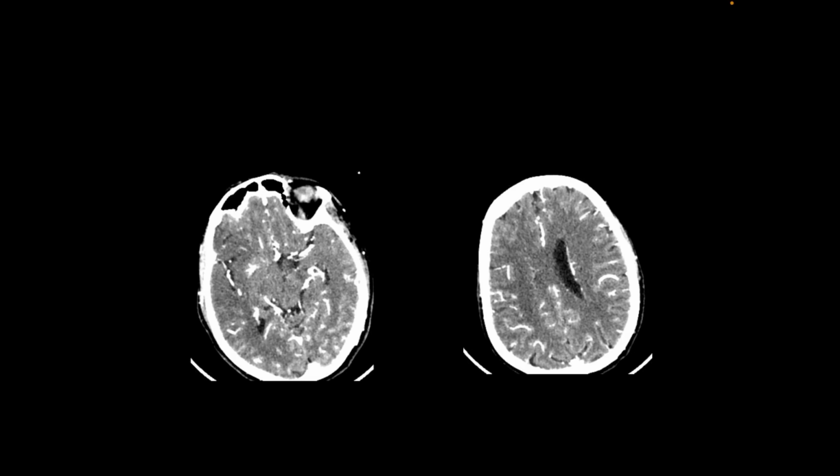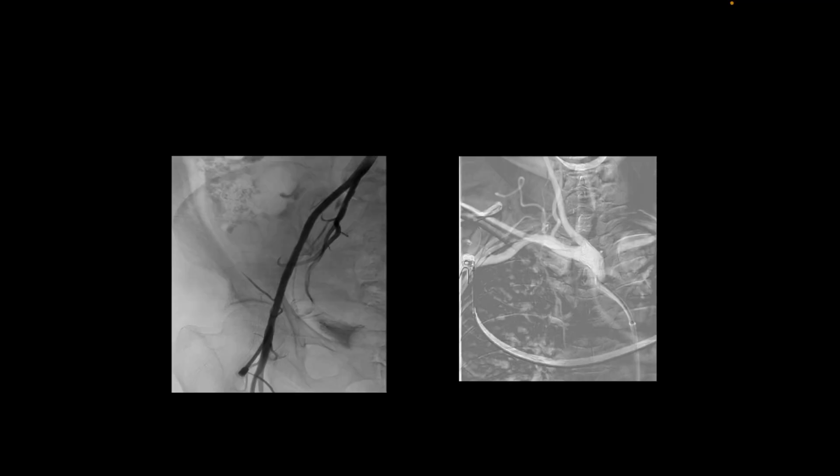But what is the impression from this CT angio? Good collaterals. So probably the patient has got good collaterals. Yes. And the patient's deficit also is not that much. And the NIH score is 10. It's not a dense hemiplegia. So even though there is an M1 cutoff, probably the good collaterals is supporting the tissue, and that is why the patient's power has not deteriorated to grade 0. Now let us have a look at the angio first.